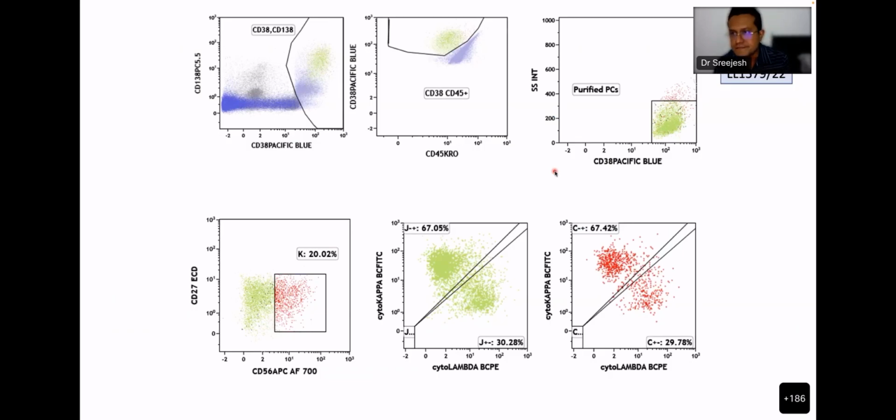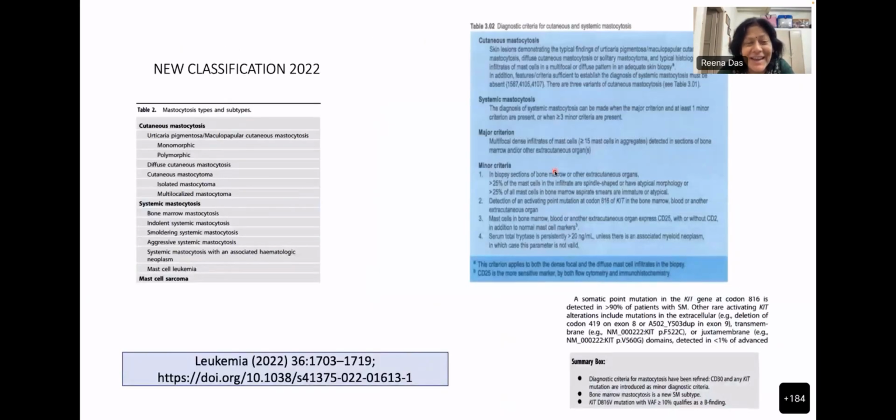Thanks a lot, Srijesh. I think you have shown a good spectrum of a lot of disorders, predominantly malignancies, that we have seen today. And for the residents, whenever you look at the peripheral smear and you are a bit undecided about whether this is going to be a benign reactive condition or blasts taking you towards a malignancy, there are two terms we sometimes use. Sometimes we say transformed lymphocytes. When we think of viral infections, they do look blastoid at times, but then we usually think of reactive conditions when we say that. When you say atypical lymphoid cells, you are probably trying to connote that this is looking like a malignancy, but you don't know what it is. Sometimes that is also a possibility.